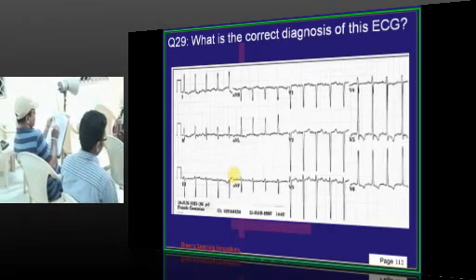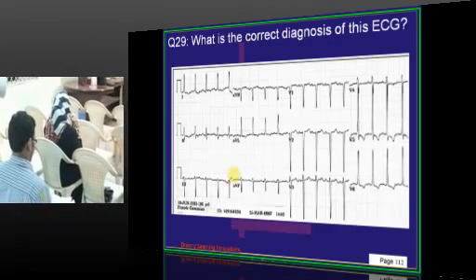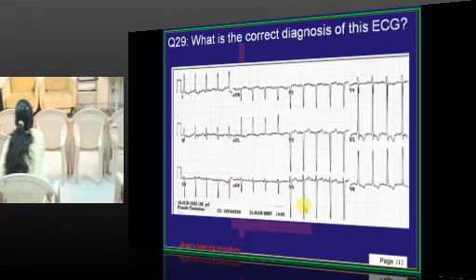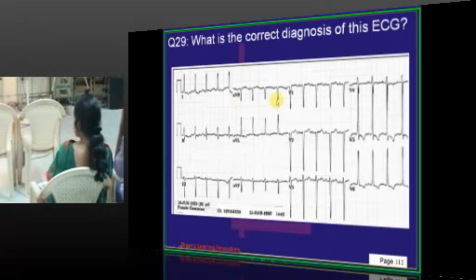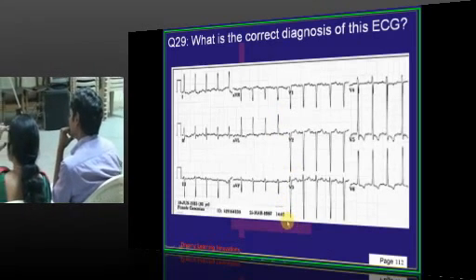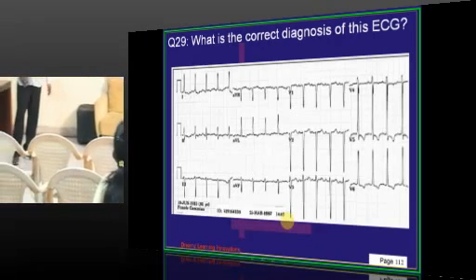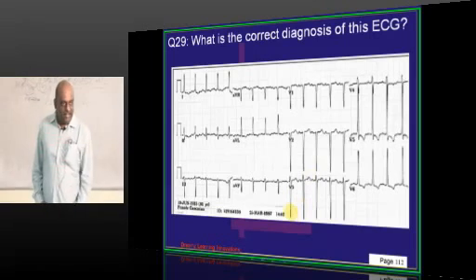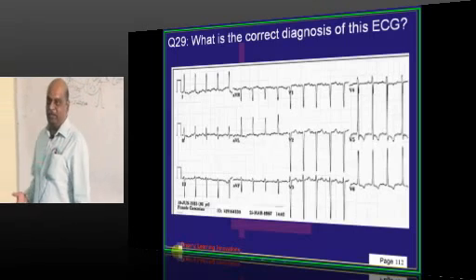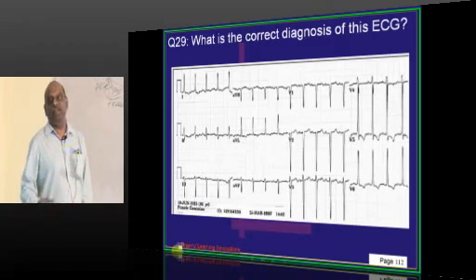So think that you are a consultant giving consultation of the ECG of a granny ma in a village who has come with an ECG on our telemedicine project. Fast diagnosis बोलना. Does she require echo or not? Is she the normal ECG or any rhythm disturbances are there? फटाफट बोलना. Hardly 10 things will be there. LVH, RVH, LAD, RAD, identifying atrial and ventricular arrhythmias, WPW patterns, fascicular blocks, bifascicular blocks.